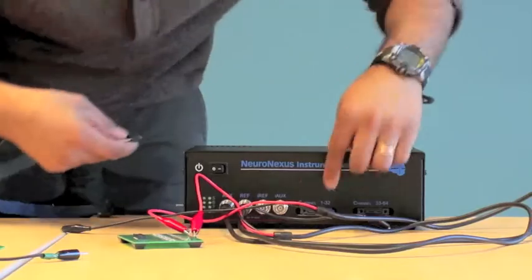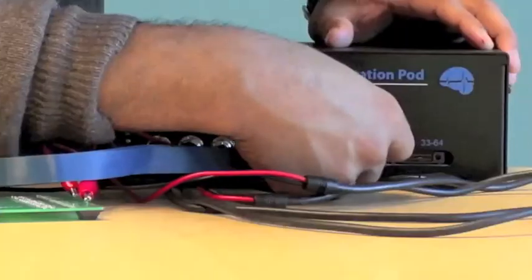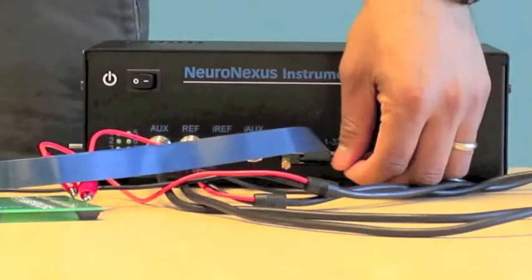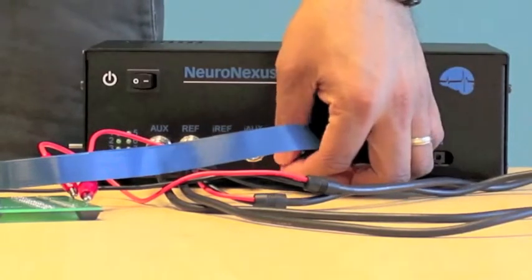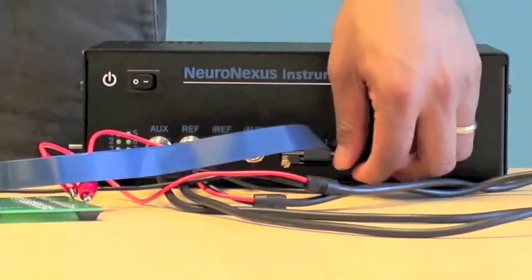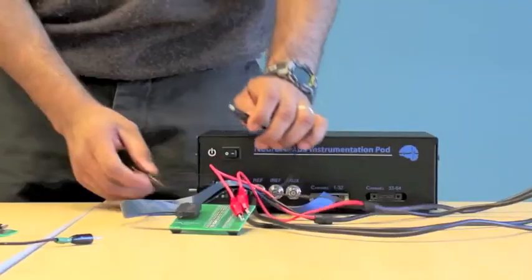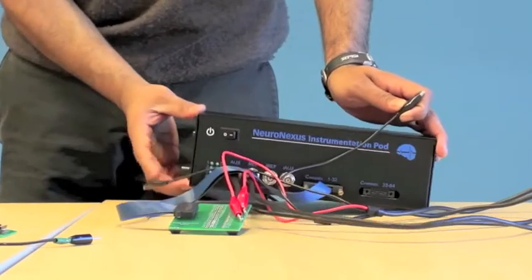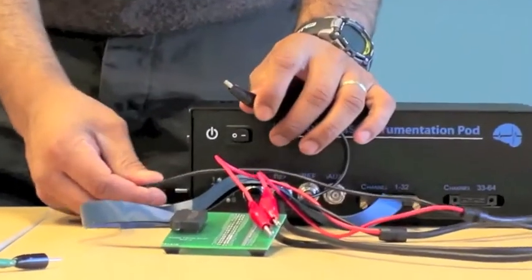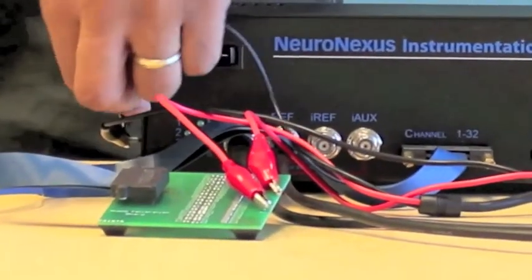Then take the blue cable and since we are only using 32 channels, plug it into the 32 channel slot and tighten. Then clip the black alligator pins to the ground pin located on the side of the Nipod body like this.